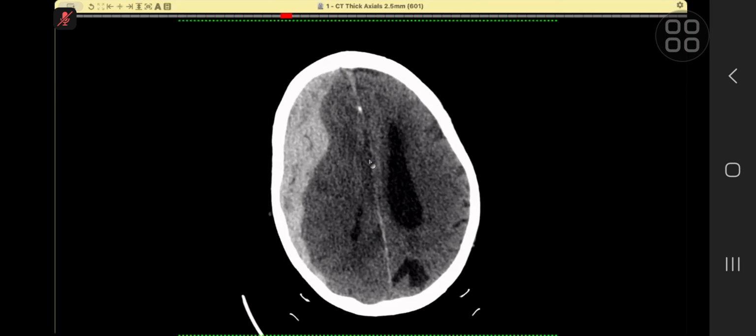Literature tells us that the level can be 75, and the width can be anywhere between 150 to 200, but to keep it simple, this is what I use: 75, 175. Please remember that in any trauma case, always use it. There is absolutely no need to use it in non-traumatic cases. And even if once a decade you save a life because of this, it will be enough.